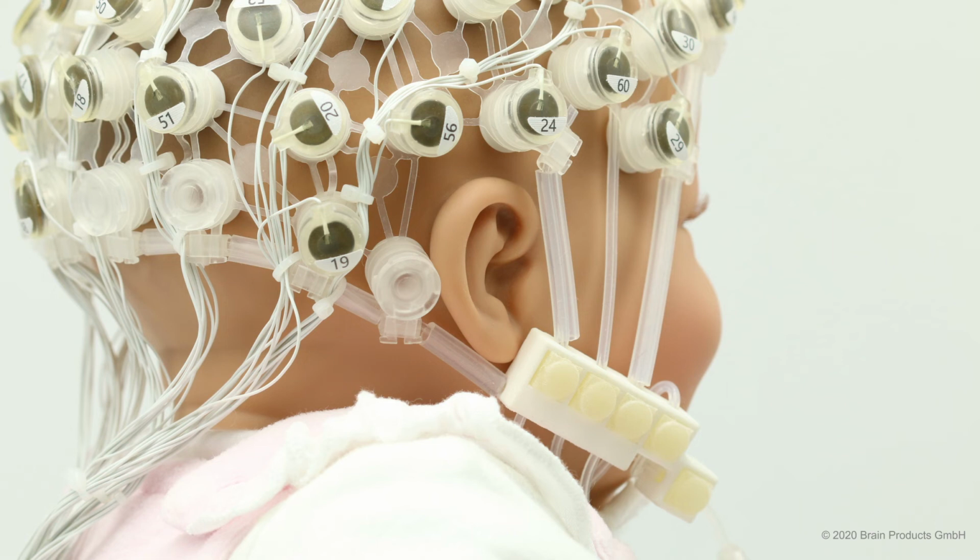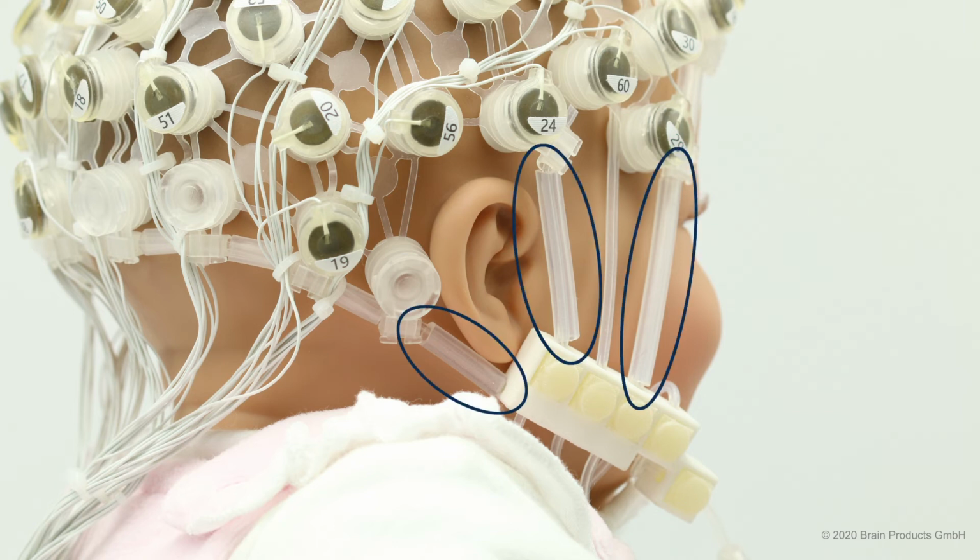With the clamping block, you can adjust all the cords individually to find the perfect fit. If necessary, you can also exchange all three of these highlighted tubes.